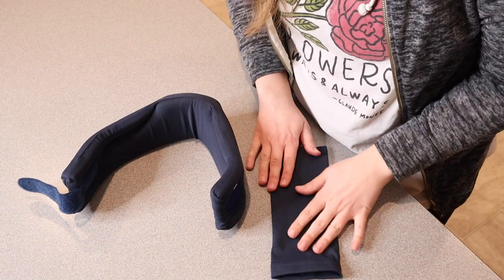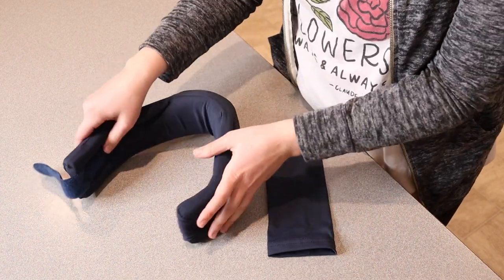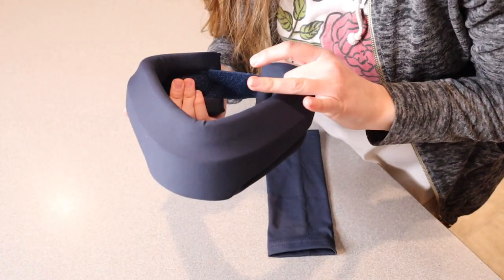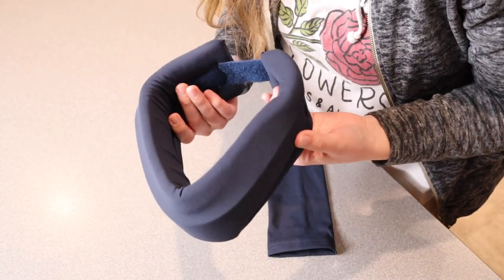Right here I have this neck brace. I'm going to go ahead and open this up and show you everything it comes with. Besides the user manual, this is everything that this neck brace comes with — it comes with the actual neck brace itself right here. First of all, I wanted to point out the shape of this neck brace.